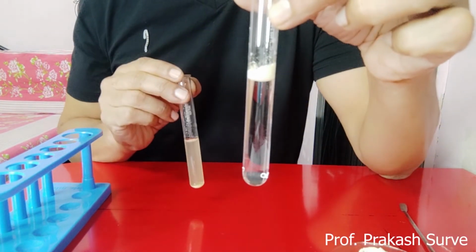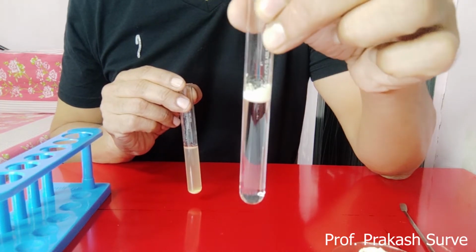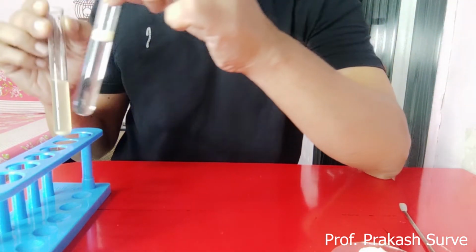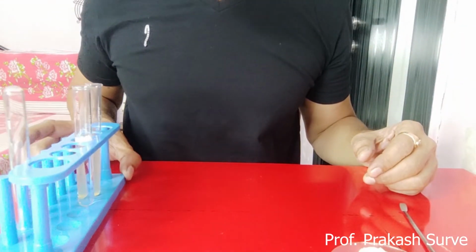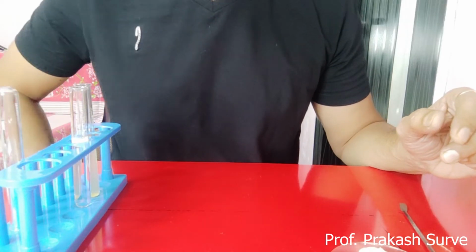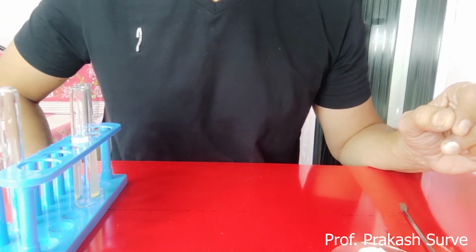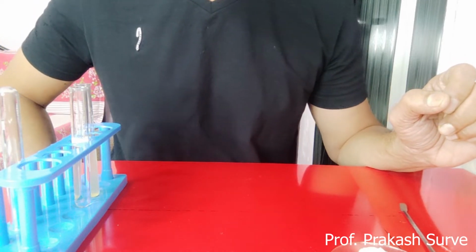This is about the plain water. So the bile salt is absent in this, and that's why the sulfur powder is floating on the surface. So this is what we have performed, the test for bile salt. The common bile salts are sodium glycocholate and sodium taurocholate. So these are the two different bile salts.